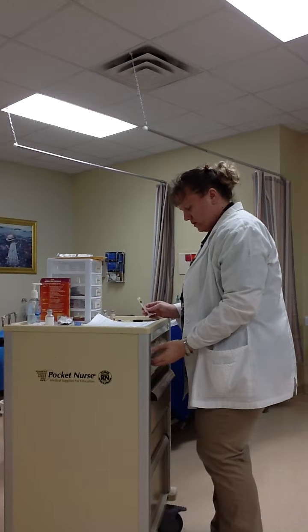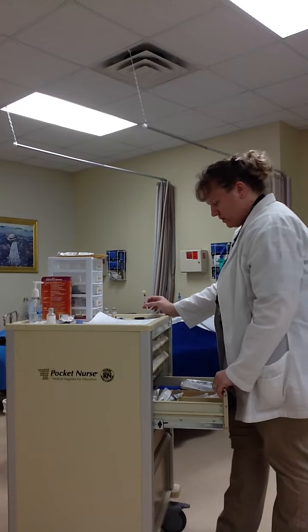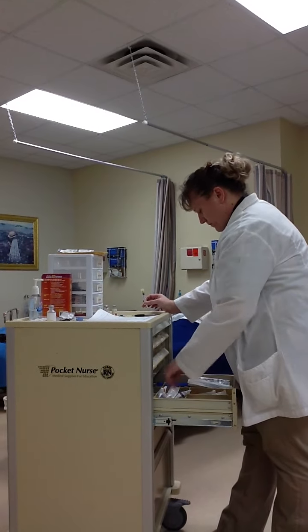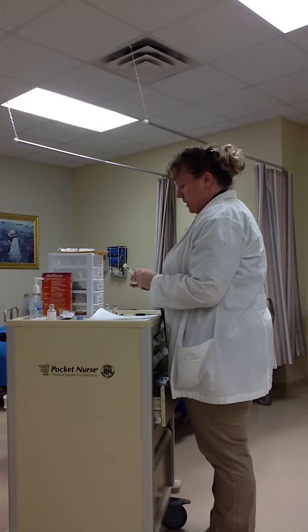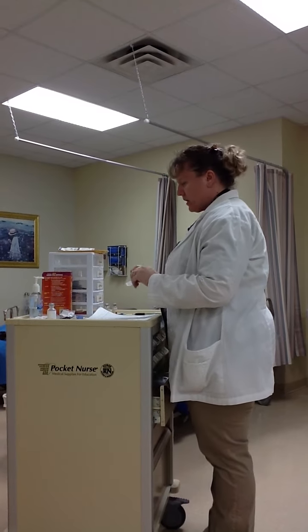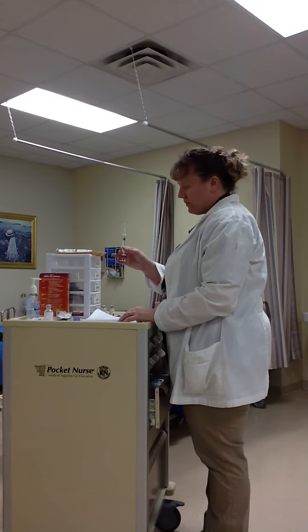So in order to give my patient, I could give this in the deltoid. So I'm going to use a 25 gauge by 1 inch. You can actually use one that is a little bit smaller. You could probably use a half for the deltoid, depending on the size of your patient. The 25 gauge is a smaller needle. It won't be so painful for the patient.